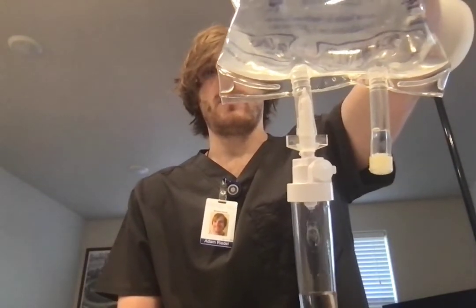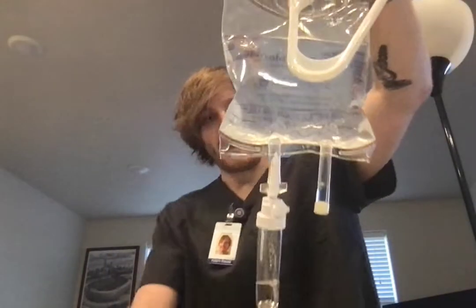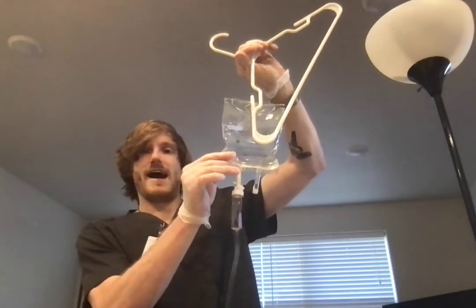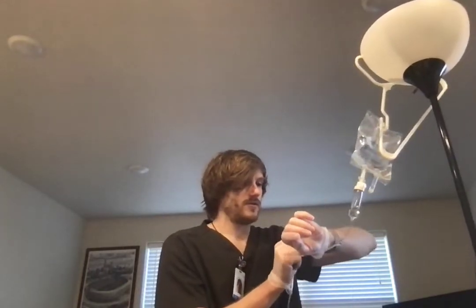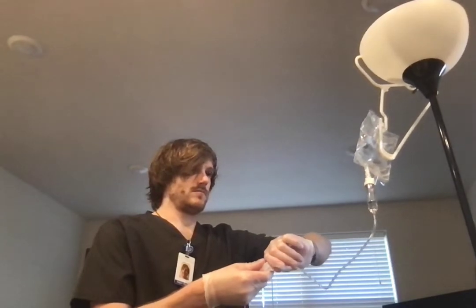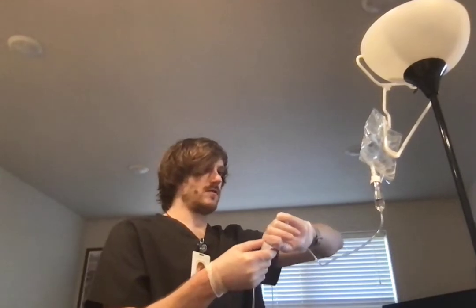As you can see, that's the drip rate right now. What we're going to do is make sure that it is going at 38 drops per minute, to make sure we're getting that 150 milliliters every hour, which is a little over half of this bag in an hour. So I'm going to time it with my watch here, and I'm going to want 38 within the minute. So it would roughly be about one every 2 seconds, more or less.